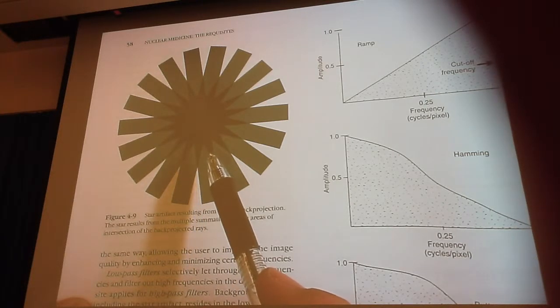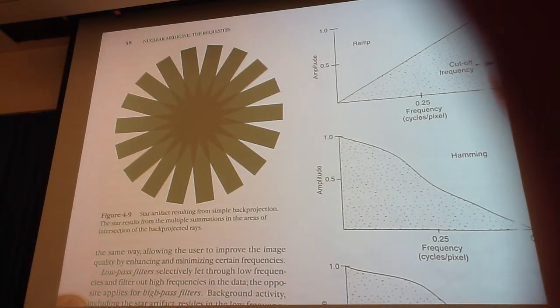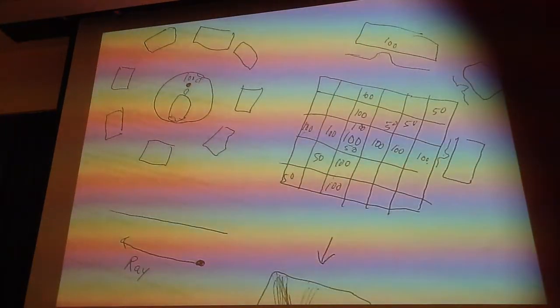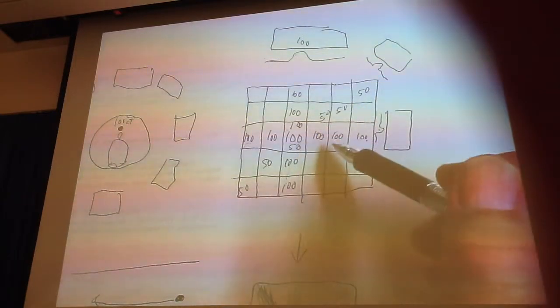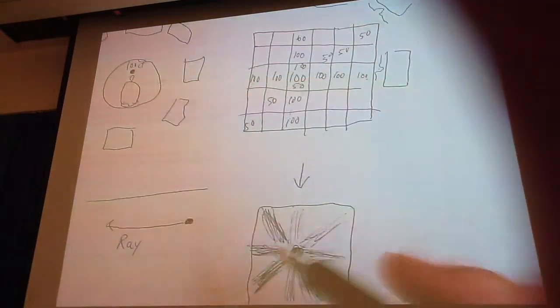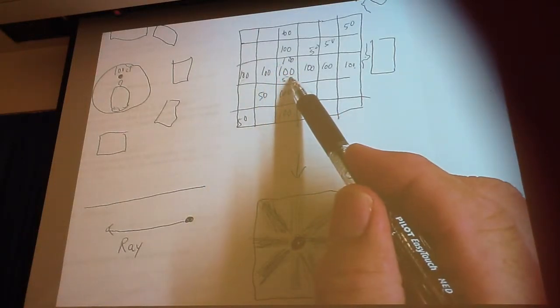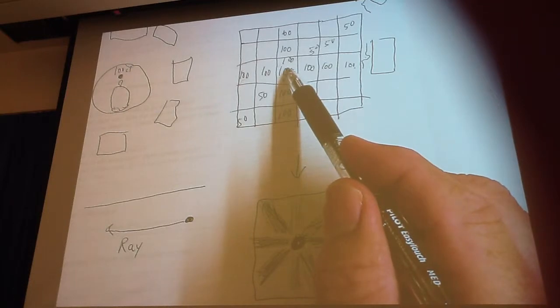It's called a convolution filter, and to make it as simple as possible, if I subtract, after my image is complete, what's going to be the number in this pixel here? 250. 250, right?